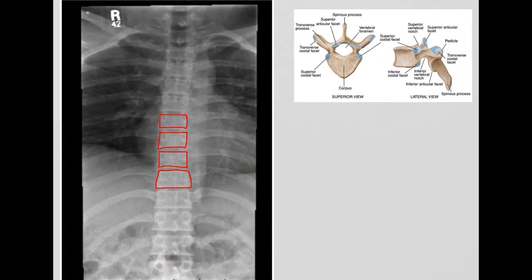Now how do you accurately count the vertebral bodies of the thoracic spine? The most accurate method is to identify the first rib and we do that by looking at this C-shaped structure up here. We find it up here near these clavicles. Here's our clavicles here. Here's clavicle here. Right around that area we are going to find this C-shape and follow it around. Now if you look at where this starts and stops here's these wings here which are transverse processes and they follow along here.